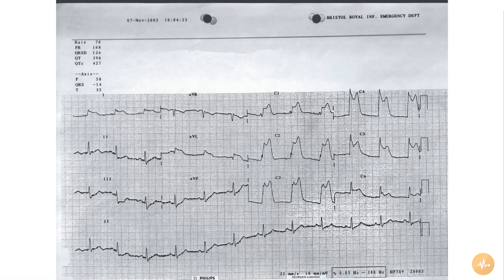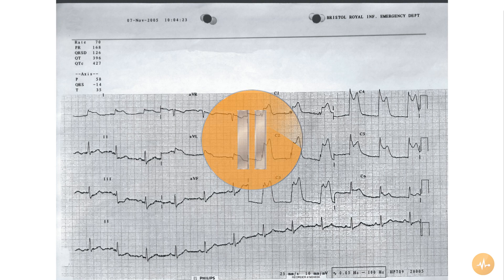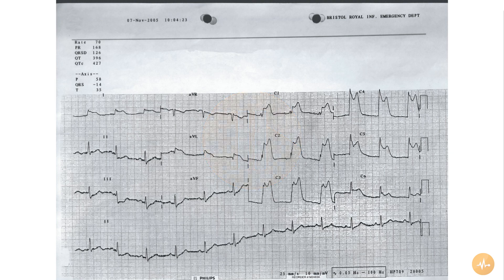This is an ECG recorded from a patient complaining of chest pain. Pause this recording now and interpret the ECG on your own, before pressing play again to hear me interpret the ECG.